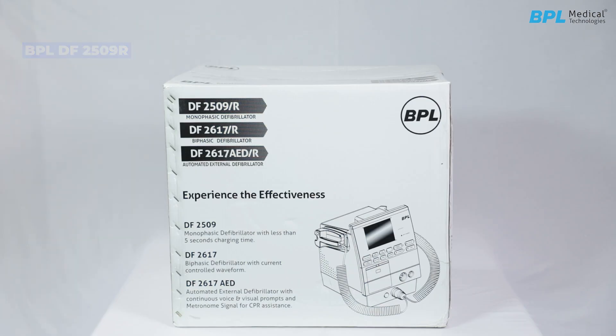Introducing the BPLDF2509R. Welcome to the guide for unpacking and operating the BPLDF2509R.